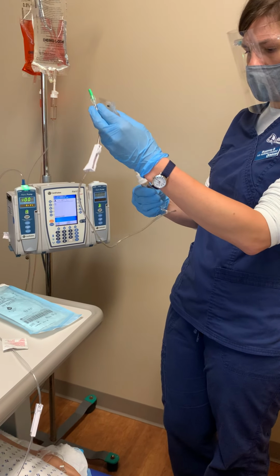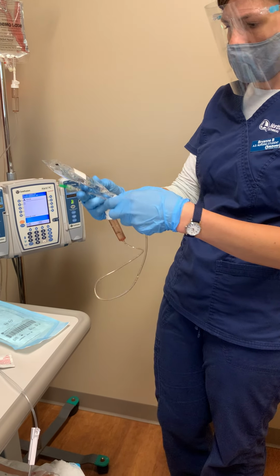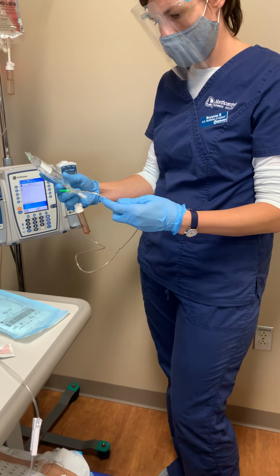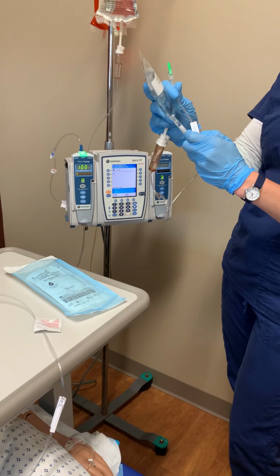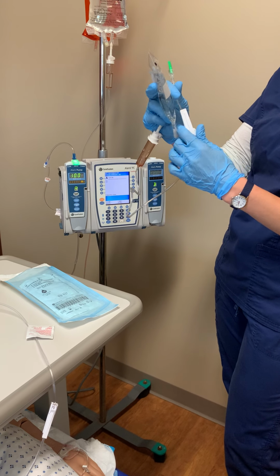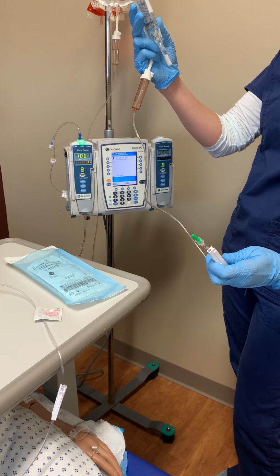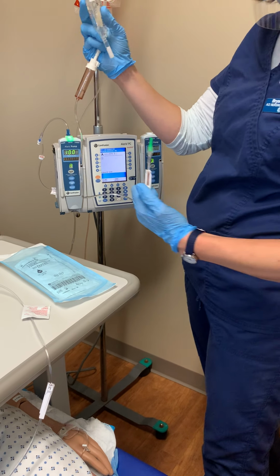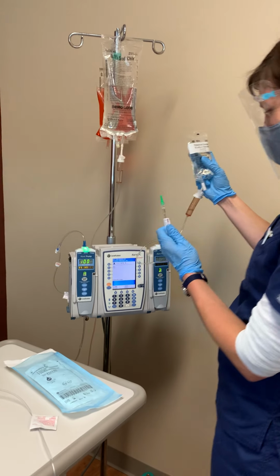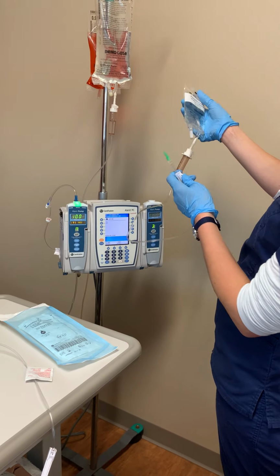I'm going to prime, and I will very carefully prime and not lose any meds. I dribbled just a little bit, but.